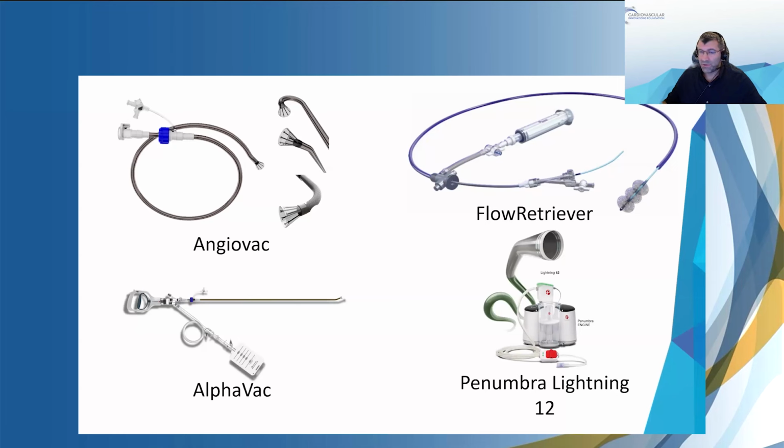Then what we've been recently doing is turning down the flows to a lower speed and cleaning up the valve a little bit to, quote unquote, debride. It's a strong word, but just imagine, on low speeds, taking out as much vegetative material as possible. That's where some of the advantages of the VAC are.